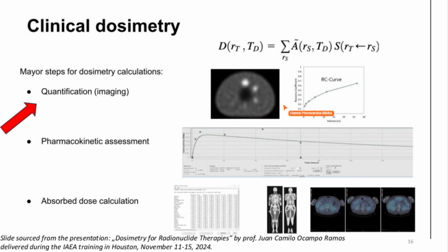Here in the slide, you can see a cross-section of the NEMA phantom. It's filled with lutetium. And on the right-hand side, this is the result of the verification, the result of the control, whether the activities are shown in the right way. The activities that have been administered to the spheres. So there are 6 hot spheres, zones. For technetium, it's very easy to see them in the cross sections. For other radioisotopes, maybe they cannot be that clear. The biggest sphere is here.